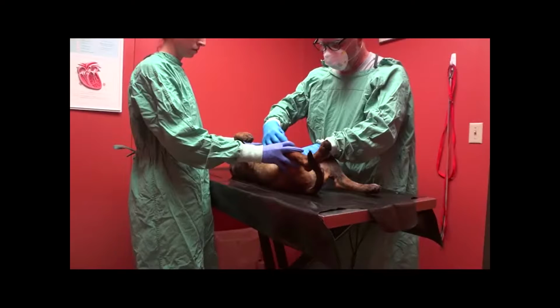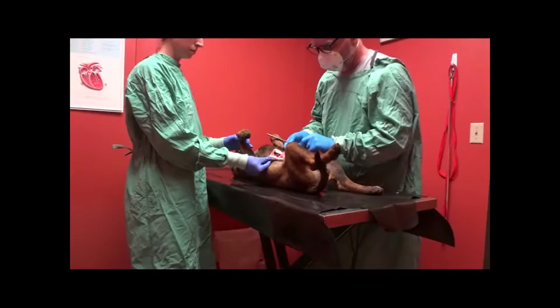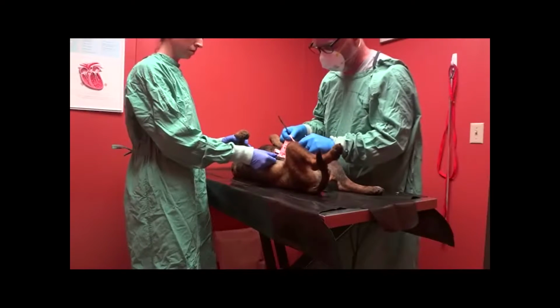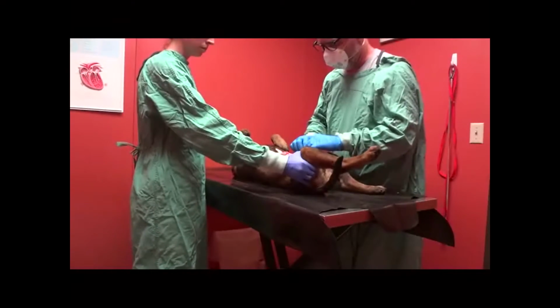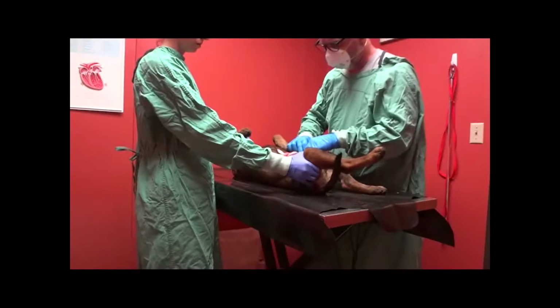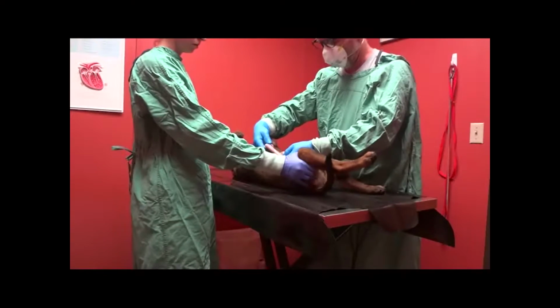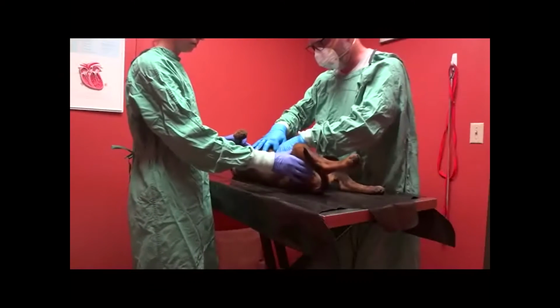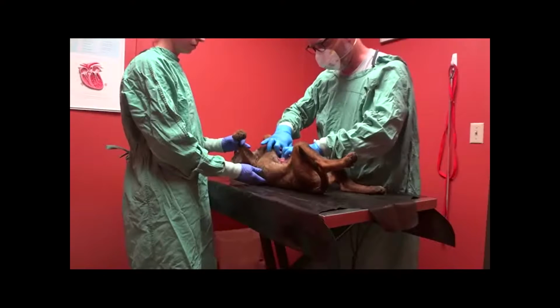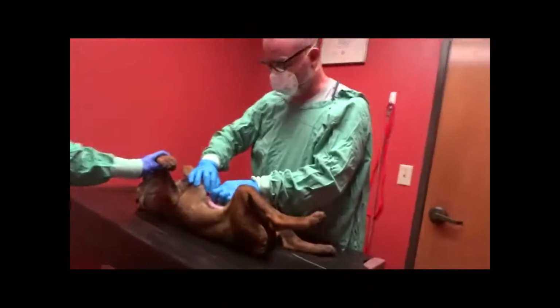Making a midline incision. Expected. We're seeing omentum covering the abdominal viscera here, jejunum. Follow that kind of here to duodenum, and there's pancreas. Follow it right up here to the pylorus, where we can see both limbs of the pancreas. We'll go ahead and get our biopsy of the liver lobe. There's the gallbladder right there, which is normal.